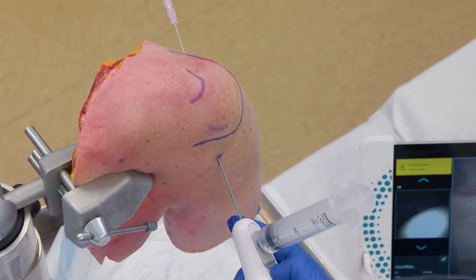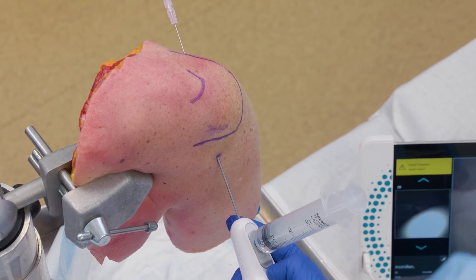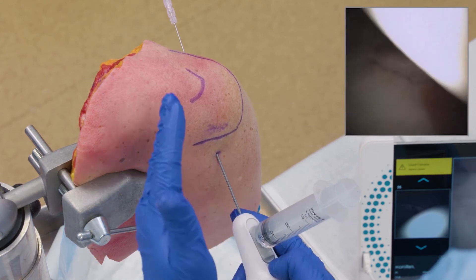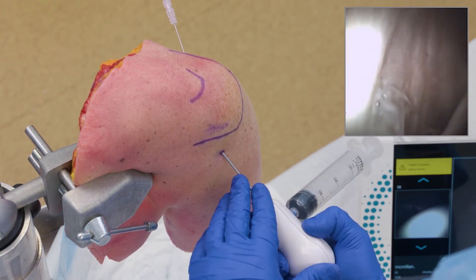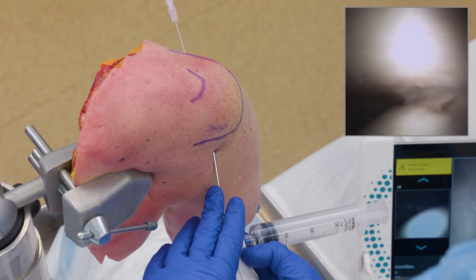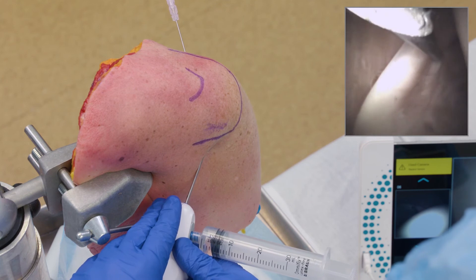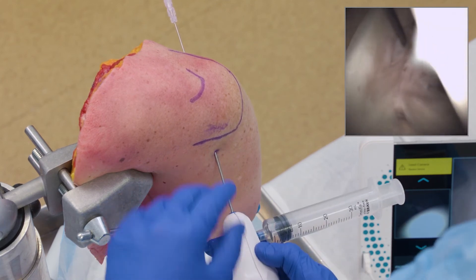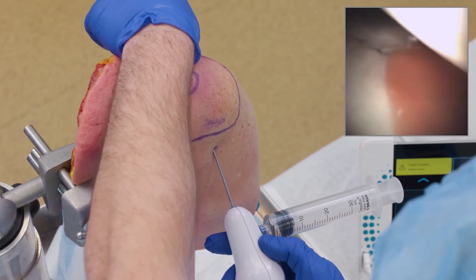For those more comfortable with their brain in the lateral position, you can do this — because it's a zero-degree scope — just by rotating your hand 90 degrees. Here I came in with the patient sitting up in a regular beach chair position, but I'm just going to rotate my hand 90 degrees. Now my brain is able to see things in a lateral position. There's my rotator cuff coming up and over, attaching to my humeral head.